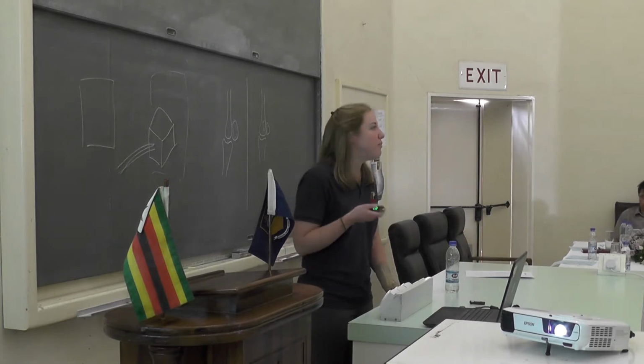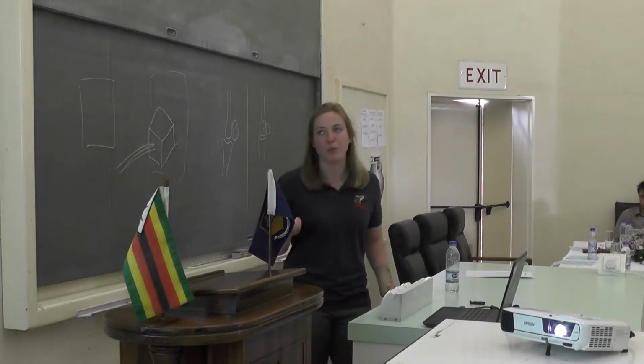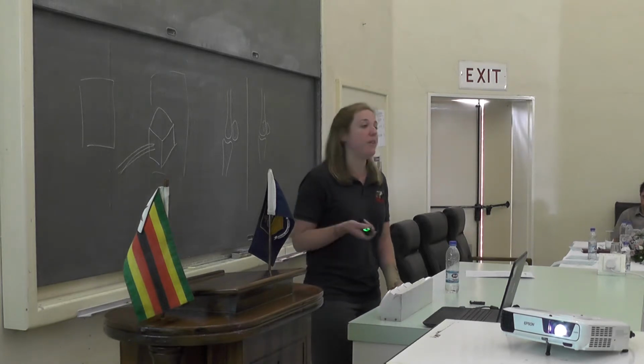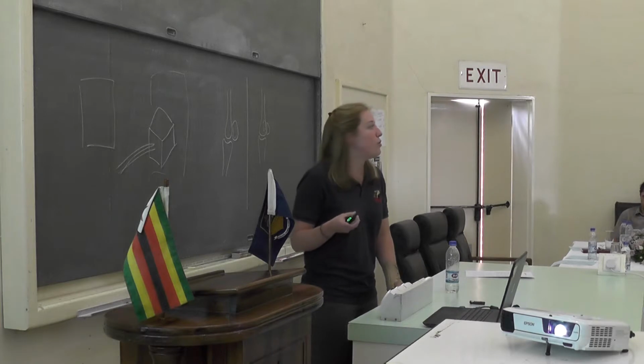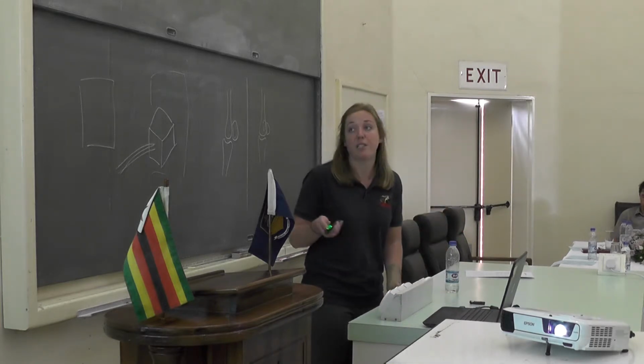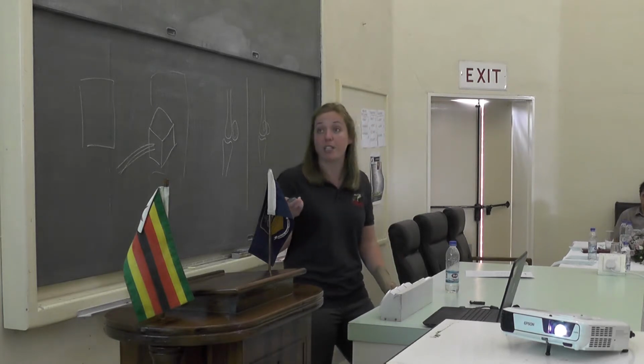And again, this depends a little bit on what you do. You normally use this mainly for foot balance and evaluating how it is, because it's not the best one to pick up pathology on P3. We'll talk about that one later. But your foot must be fully weight-bearing, because if the animal is leaning, then you don't know whether that's a true distortion of the anatomy, or if it's just the animal and therefore an artifact.